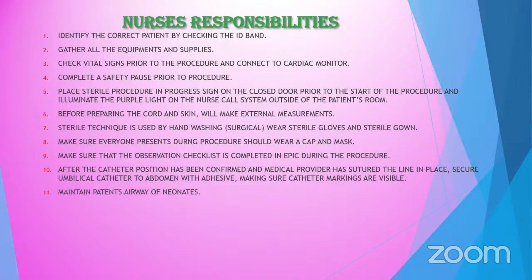And then maintain a patent airway of the neonate. While doing before, during, and after, we should maintain a patent airway of the neonate. For example, if the patient is ventilated with an ETT, it is very important to always check if the baby is okay.